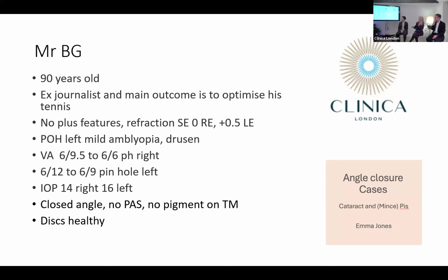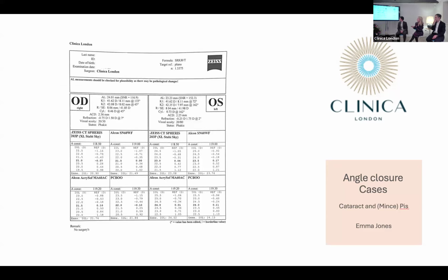So this is his biometry. And interestingly, he does have quite a shallow anterior chamber, even though he's got a long eye. But then your lens gets bigger as you get older, doesn't it? So yeah, he has got quite a shallow anterior chamber.